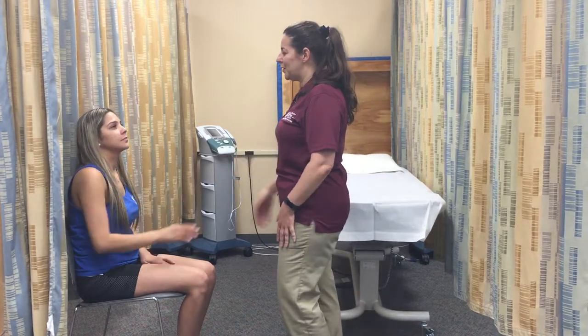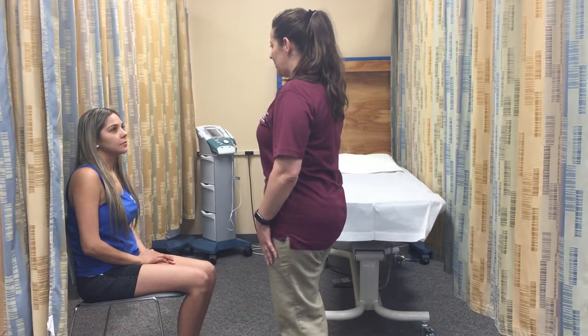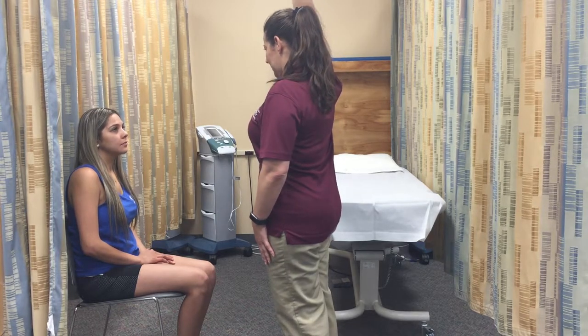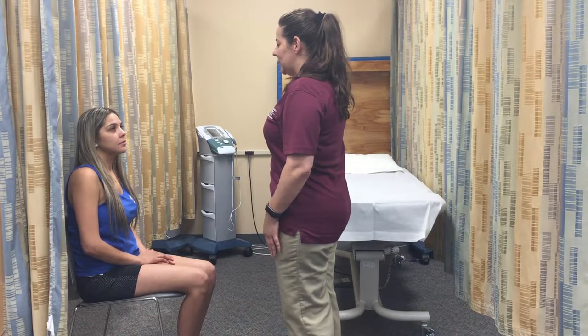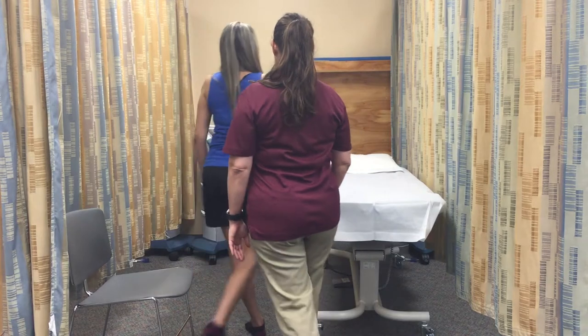Hello, my name is Johanna. Today I'm going to be making the measurement of the range of motion of this action. You're going to be moving your arm away from the body to see if you have any kind of impairment. I need you to lay down, face up.